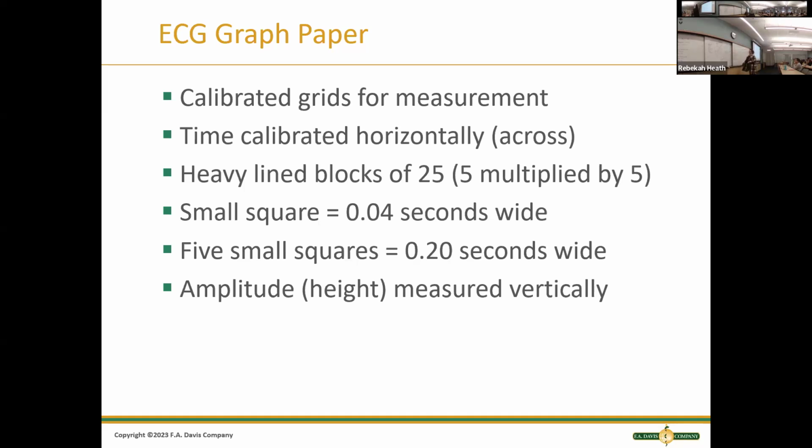Now it makes sense that the P wave is smaller than the QRS, right? Because when you look here, we have the signal, but there's a lot more electricity just from the size of the ventricles flowing through. That's where the QRS is a lot larger. There's more voltage in that. Now, when you have those boxes, those ones are 0.04 seconds each.